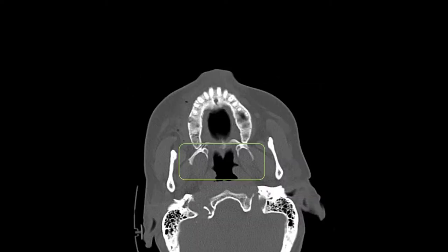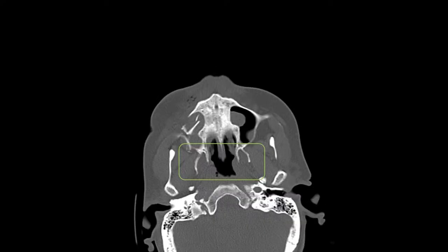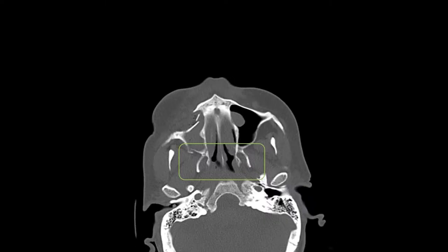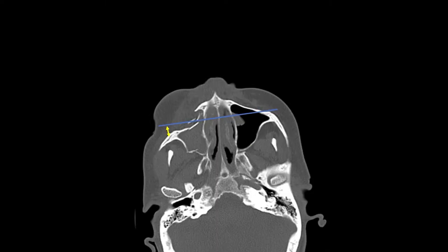We'll start by examining some notable findings. Here in the green rectangle shows bilateral pterygoid plates. Scrolling through, you can see there may be a hairline fracture located here, but the slice above shows the pterygoid is intact. So this particular patient does not have bilateral pterygoid fractures. I anticipate that the patient's palate is not mobile and there is no malocclusion.